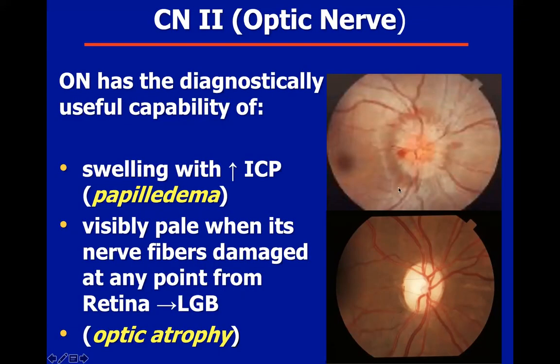What happens when your optic disc is swollen, or what we refer to as papilloedema? As you can see, I cannot trace it. I don't know where the borders are. You see a little hemorrhage there, which is abnormal. Also, I cannot even trace the vessels.